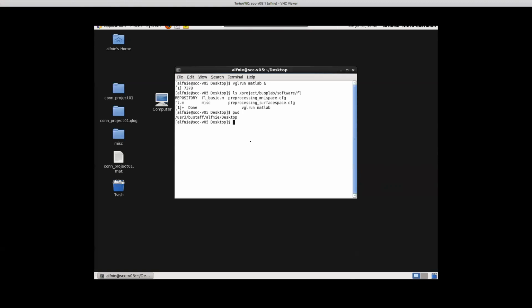And that is just a two-dimensional interpolation of the position of those subject-specific vertices. Well, it's a two-dimensional interpolation, but it's on the surface of a sphere, actually, where that interpolation takes place. I don't know if that clarifies. So this extraction does two things simultaneously.